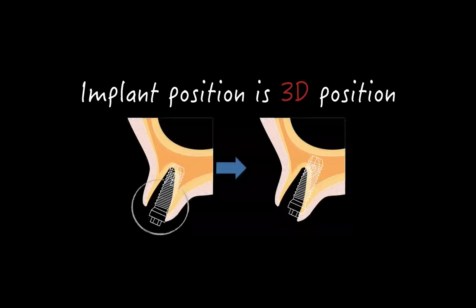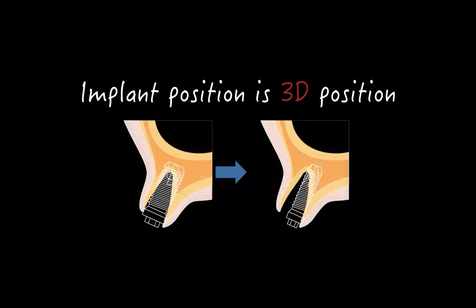Another thing we used to go ahead and do is, again, this is the image of putting an implant further back, but putting it right by the crest. Another one was, we thought that the bigger the implant is going to be and the more space you eat of the extraction site, it will be the best for the implant, right?